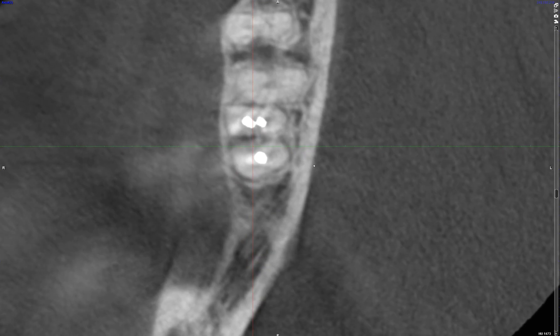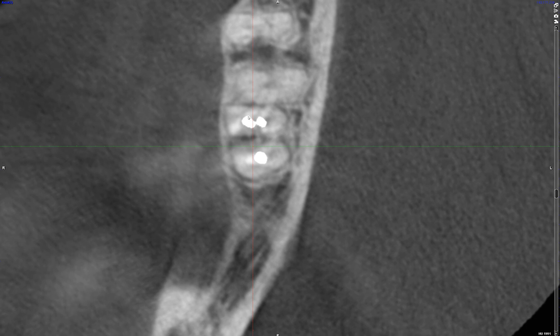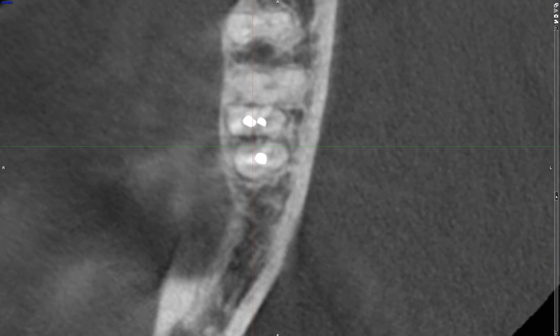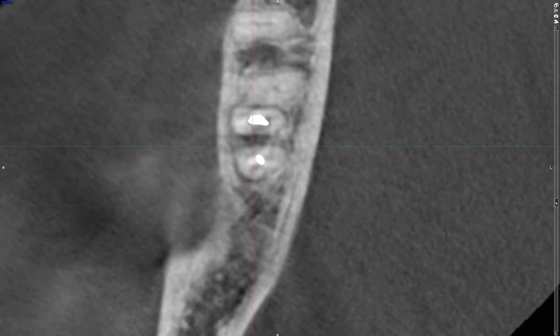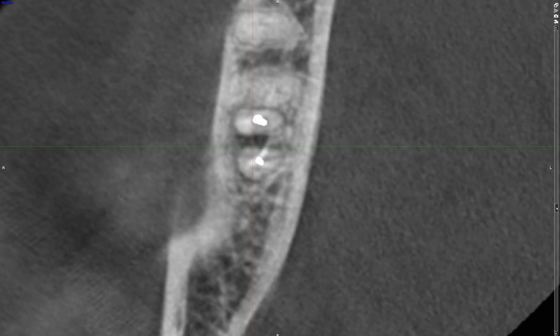Just to help you get oriented, we're looking at the mesial root and the distal root. And immediately you can start to see very highly radio-opaque entities consistent with endodontic filling material within the mesial buccal, mesial lingual, and the distal canal. So let's go ahead and try to follow along the filling material as best as we can.